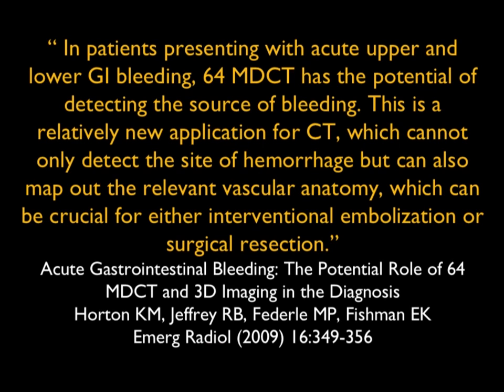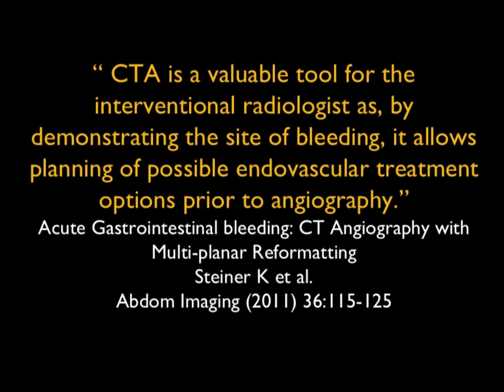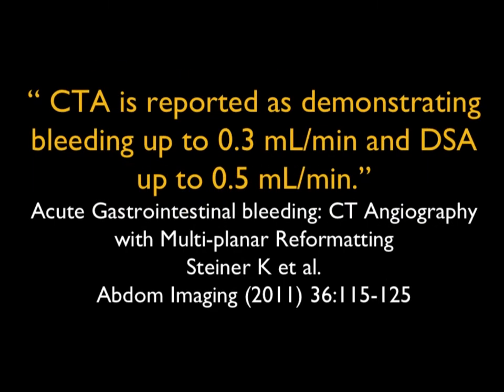Articles like those by Karen Horton have talked about the value of CT in GI bleeding. Articles by Steiner have often shown how it's a critical part also of interventional radiology, because you don't want to do an angio on a patient who has a negative GI bleeding study with CT. And the fact is CT is better than DSA for picking up small bleeds.